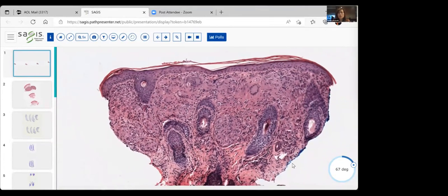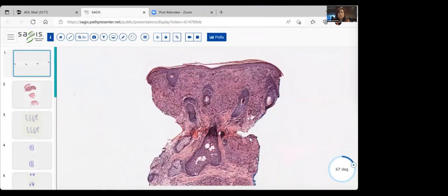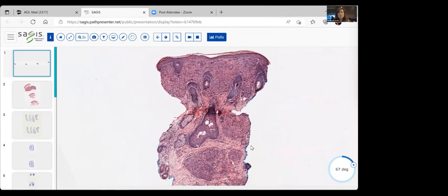And the other thing you must do is make sure that it isn't a kind of hidden infectious condition. And so you may be asked to do another punch biopsy for tissue stains and for tissue culture. So this is a great example of, and I'm going to pull outward in the magnification so you can see again, a type of granulomatous dermatitis consisting of histiocytes. It's somewhat naked, and this is just a beautiful example of sarcoidosis.